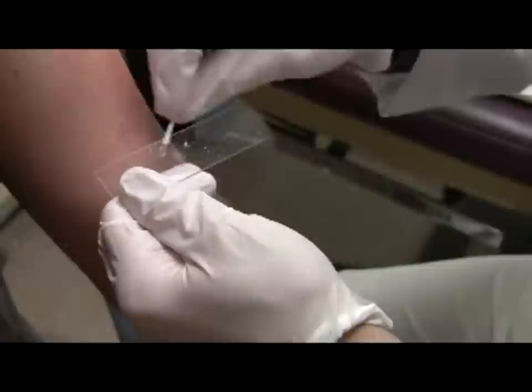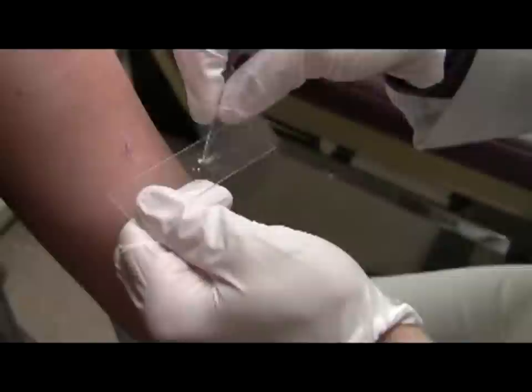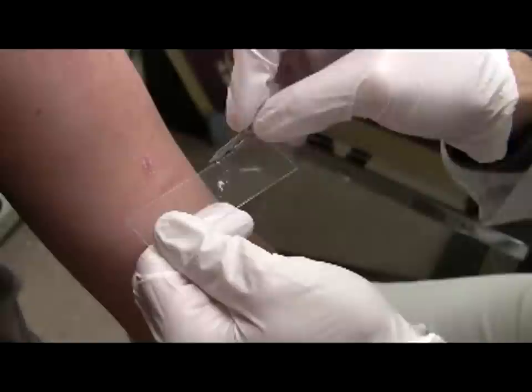If taking a scraping from a toe web, using a 15 blade may be easier. In this case, the macerated scale should stick to the blade such that you can smear the material onto the glass slide.